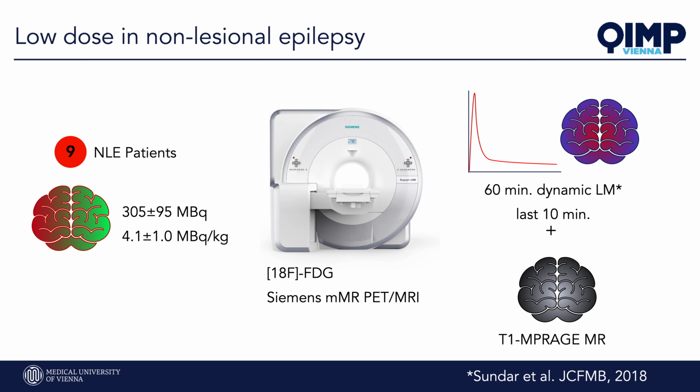Another interesting study that I would like to mention was where we were looking at non-lesional epilepsy patients who underwent PET MRI scans. The data actually was a dynamic scan, but for our purpose of the study, we used the last 10 minutes of the data, and we had access to T1 MR images as well. The injected activities were fairly high, and for this study as well, we used the same methodology to virtually reduce counts in the list mode data.